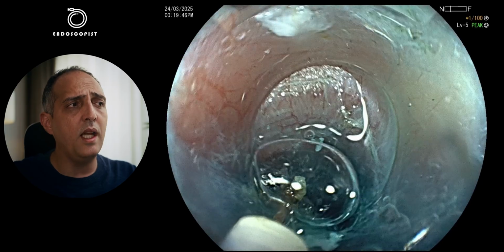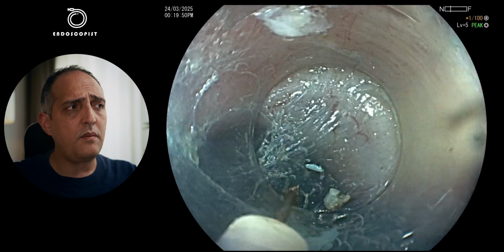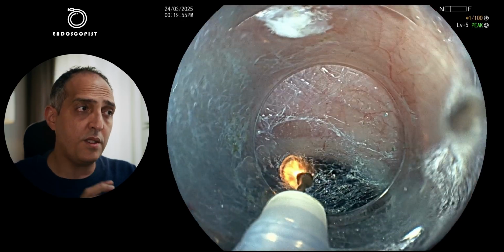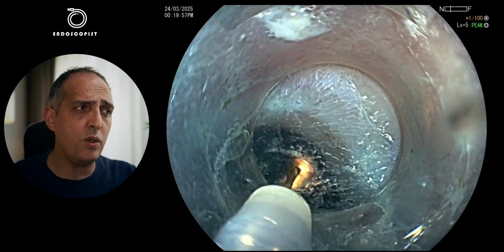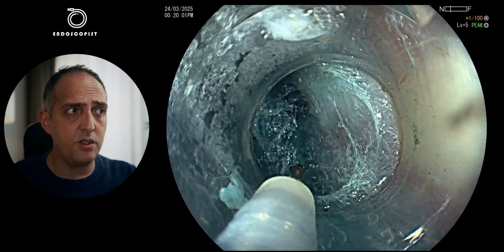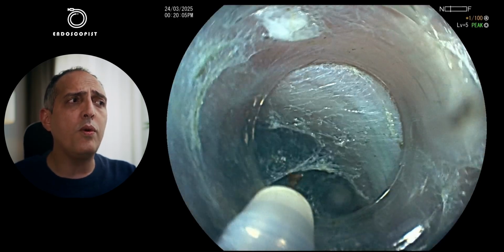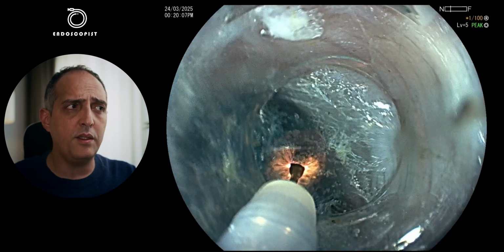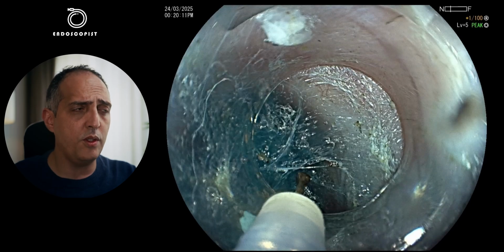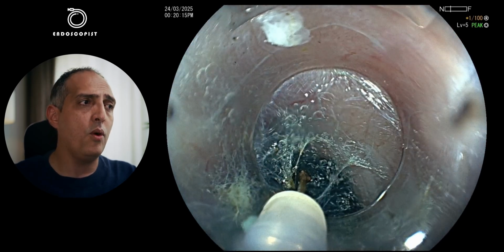After I enter the tunnel, I keep myself very near to the muscle layer, and I use the cap to do physical traction or pressure on the submucosa, which will allow me to open the tunnel, something like dilatation of the strictures. And this will allow me to do dissection of the submucosa with minimal current, with minimal electricity, and save time, and use minimal electricity, which will diminish as well the mediastinitis, which will happen after the POEM.